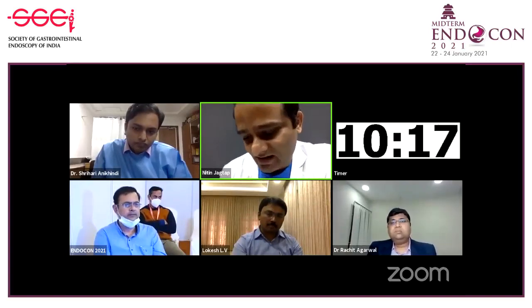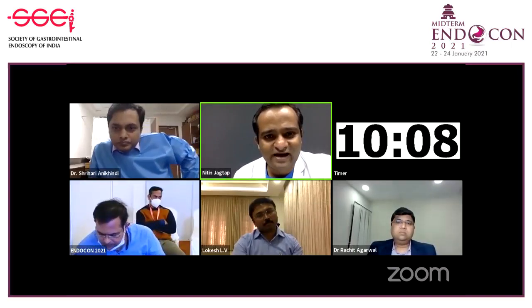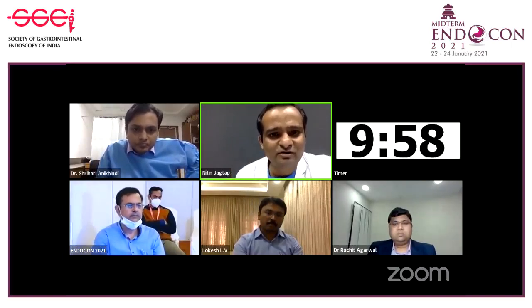That's one thing. And additionally, when you are doing APC and this procedure takes around 30 minutes, your stomach gets distended, and due to that gas, your vision also gets obscured. So we advise to use a larger therapeutic scope, 290 series, which has more than 3.5 mm of channel, so that the suction will be more efficient, and your procedure time will be maintained at less than 30 minutes. So these are 3-4 points that one should remember when you are doing ARMA procedures.